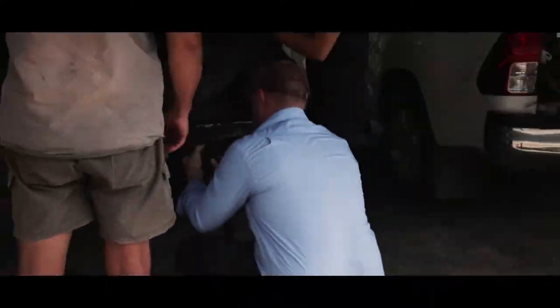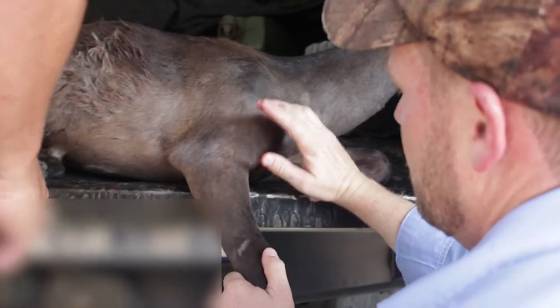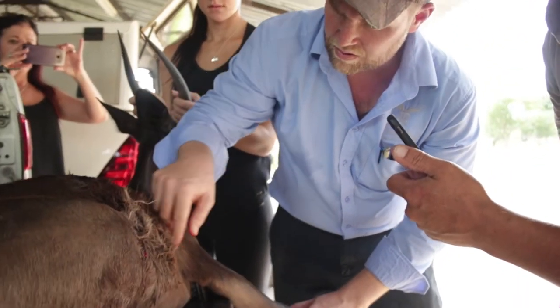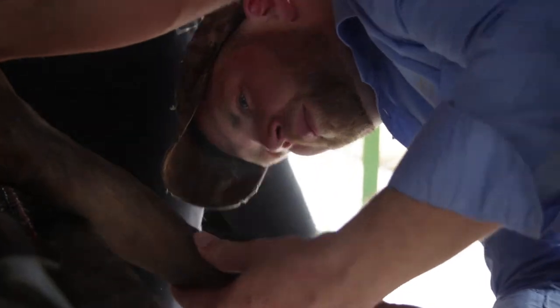We're going to do it blind, meaning we just feel, align, and then use the circular external fixator to work from there. In terms of if it was lung, the blood from the lung is different - you have that super pink foamy kind versus normal blood. This could just be from the fence - there's a hole there, there's a hole there, there's a hole there - so you've just got a bit of air underneath.